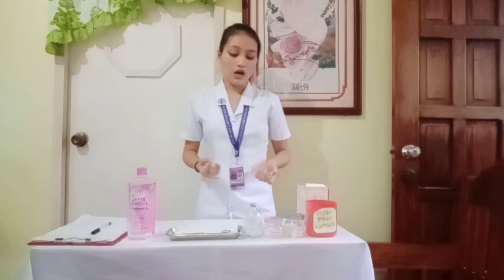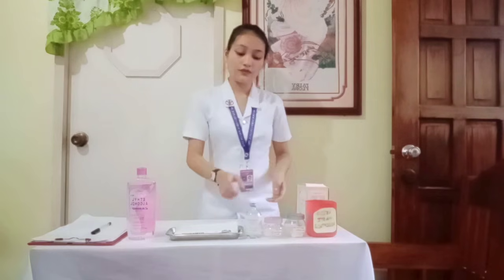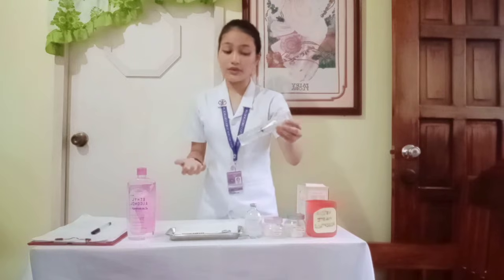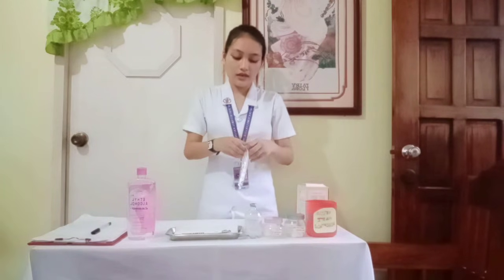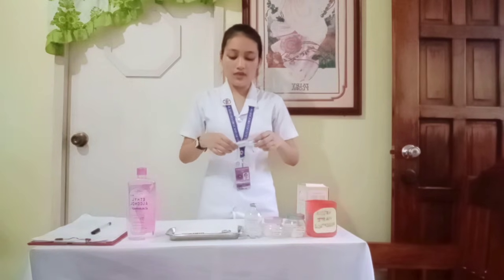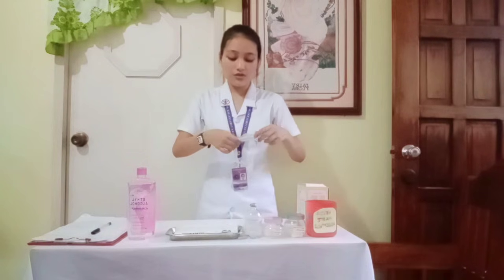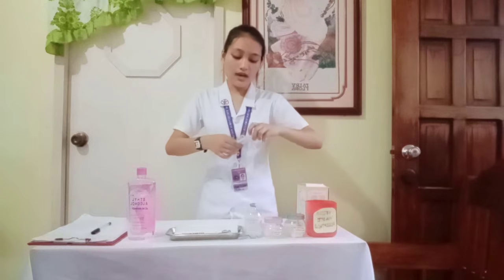Now that we have the exact dosage needed, we can now draw the medication from this medication vial. Of course, we'll need to have a syringe with a gauge 23 needle. You can now open the sterile pack. Always remember to only touch the barrel and the plunger of the syringe. Since my syringe is readily connected to the needle, it has to be separated first so that I can connect the syringe into an aspirating needle to draw the medication.